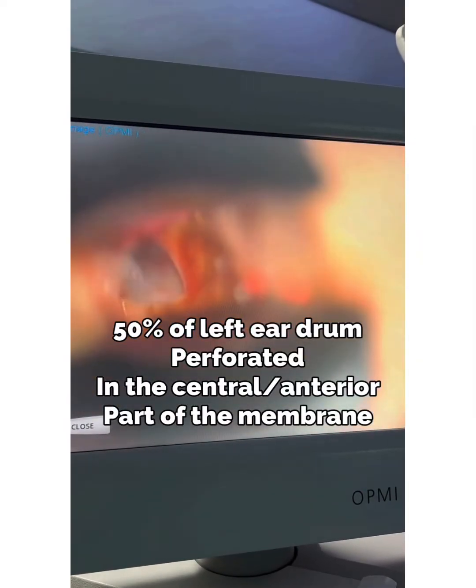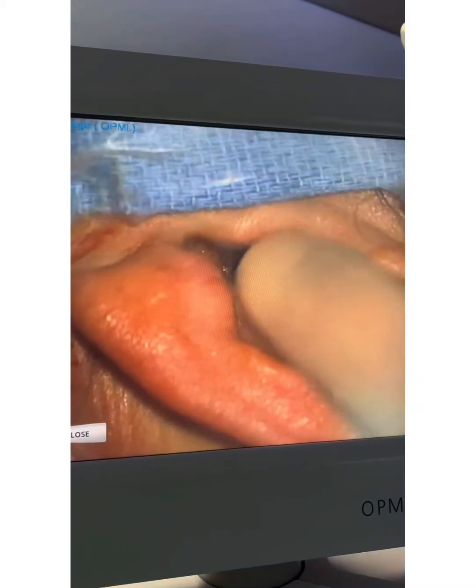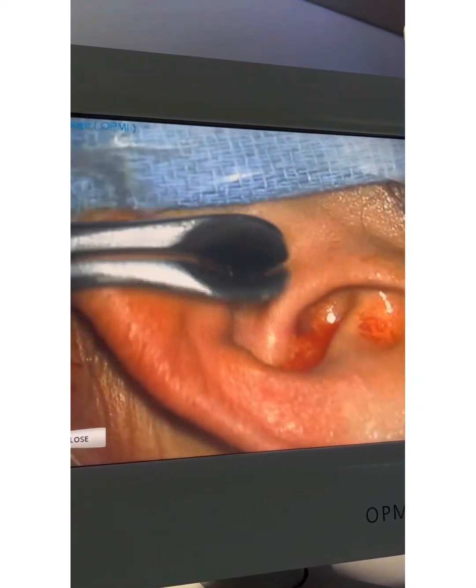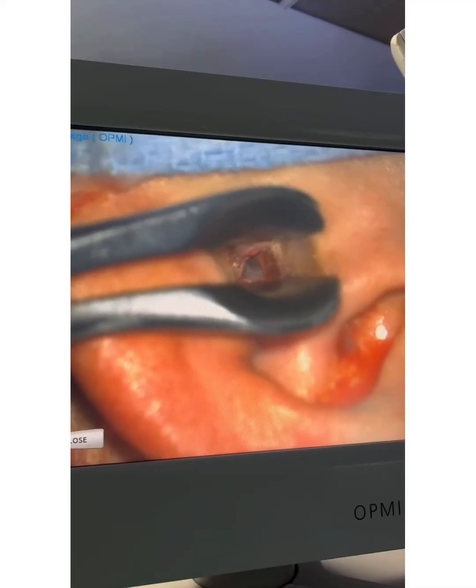You can see that's the eardrum of the patient's left ear and there's a big hole in it. We're going to use her own cartilage from the outer ear, right over here where my finger is, and we're going to slice it and create a new eardrum for her. That's called a tympanoplasty. I'm going to show you guys as we proceed how it's going.